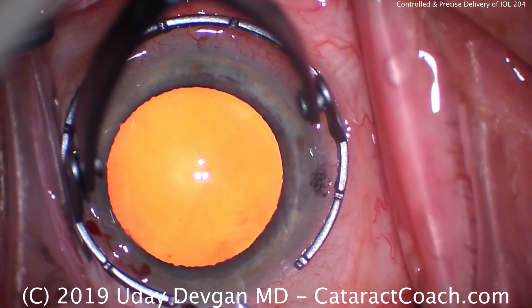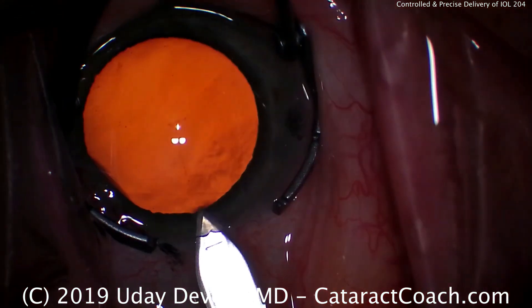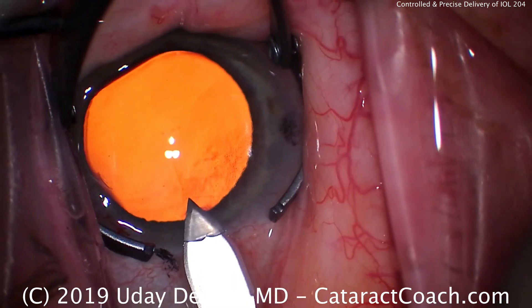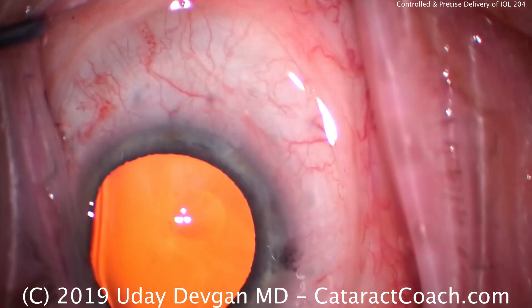This is CataractCoach.com. This is a routine case, and we're going to fast forward through most of it. Here's the nice incision at the beginning of the case — a single plane made with a steel keratome that has beautiful architecture. That's just about perfect.